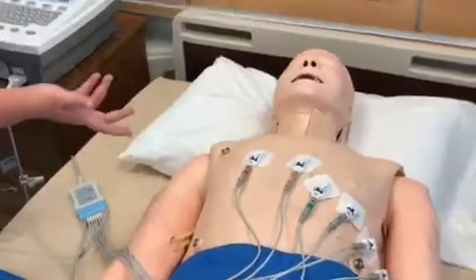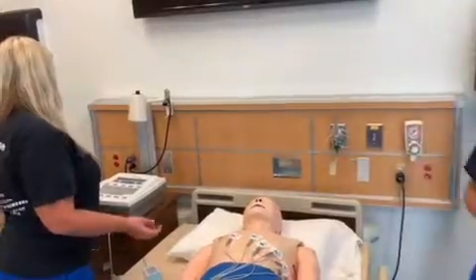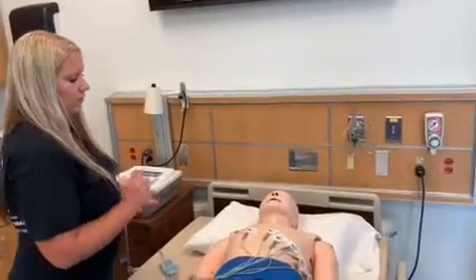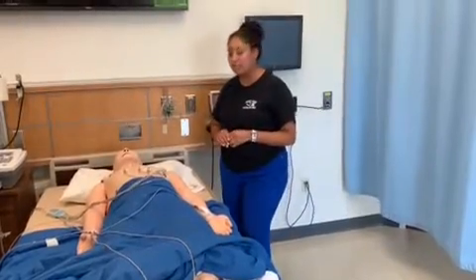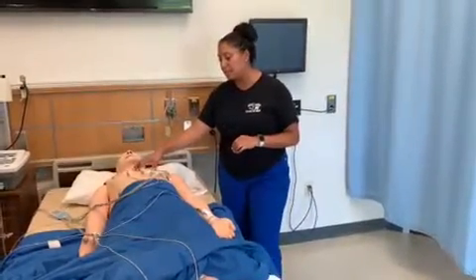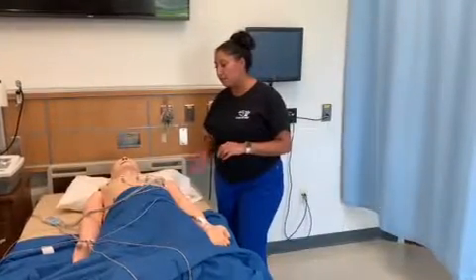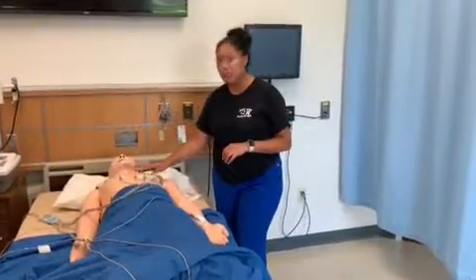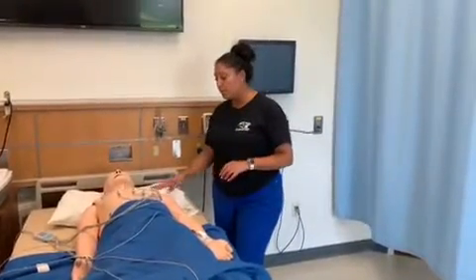Some reasons why people might need a right-sided 12-lead EKG is because they can have congenital heart defects or a possible acute MI. So some other tips that you should consider when putting on an EKG: you want to make sure that the patient's chest is completely bare of any hair. Also, if they're diaphoretic, get a towel and dry them off completely, and make sure that the patient keeps completely still when performing the test.